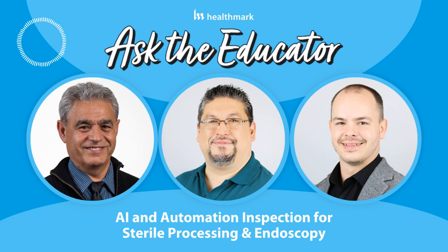What is verification? What can you do with your eyes? But when we take a deeper dive, we cannot see a lot of things with our naked eyes. We need some kind of magnification, some kind of lighted magnification. Obviously, those work really well for the outside.